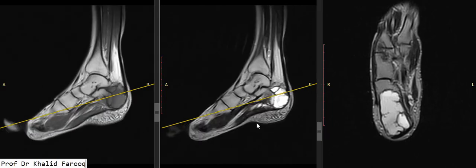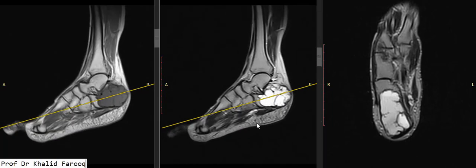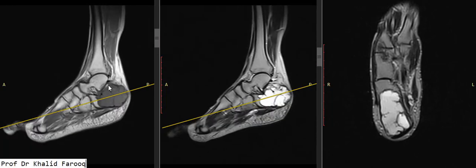So this is an example of an expansile lytic lesion involving the calcaneum, with a very sharp zone of transition, having multiple septa with fluid-fluid level suggesting aneurysmal bone cyst. As the lesion abuts the articular surface, its differential would be with giant cell tumor.